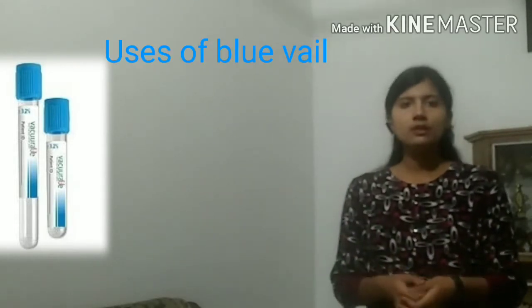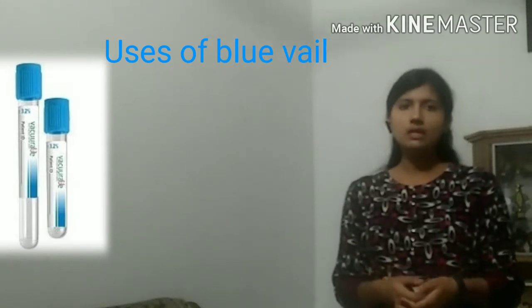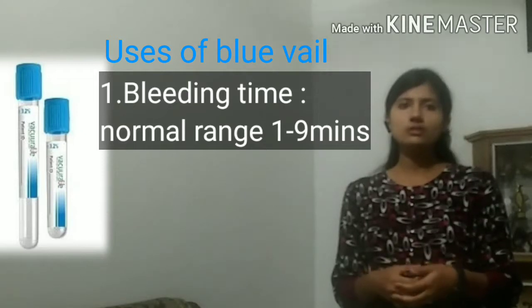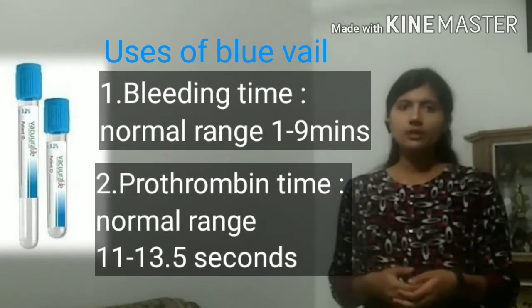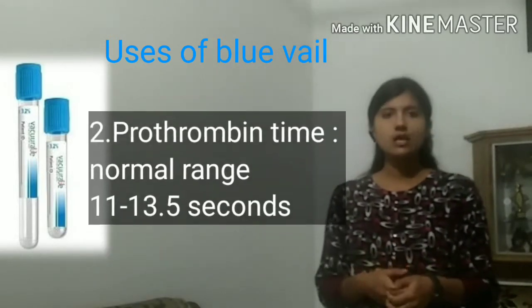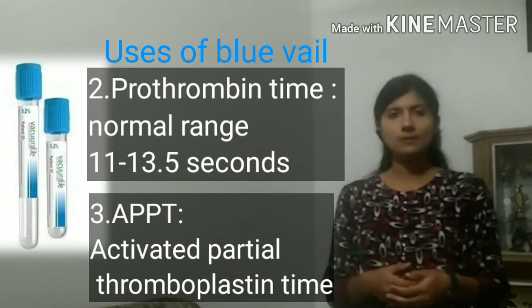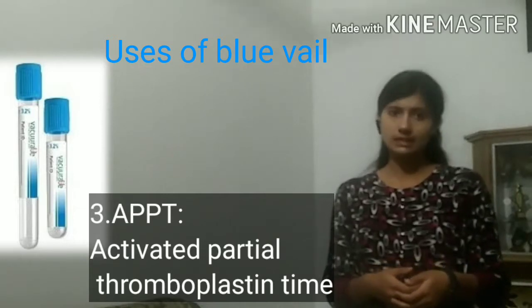Uses of blue vial. The blue vials are used mainly for coagulation studies. For example, first, testing bleeding time. Normally, the bleeding time results between 1 to 9 minutes. Second, prothrombin time. It normally results between 11 to 13.5 seconds. Third, APTT or activated partial thromboplastin time, which normally ranges between 30 to 40 seconds.